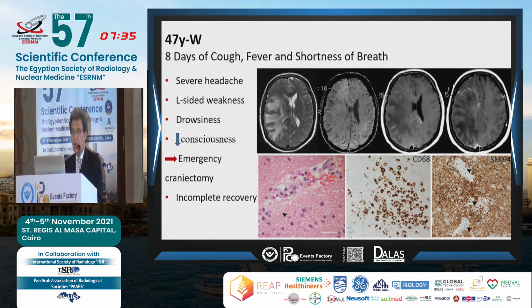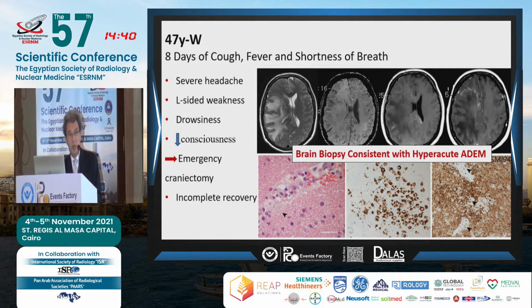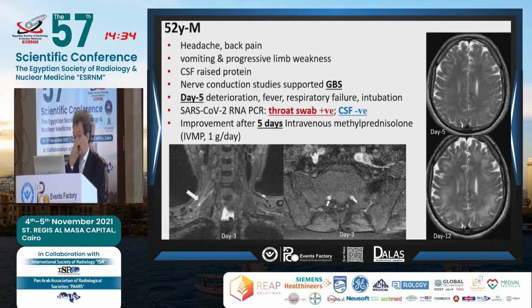A further patient, 8 days of cough, severe headache, then started weakness and loss of consciousness, had an emergency craniectomy. If you look at the scan, you have a midline shift, which is quite substantial, something that is causing a mass, but there's not much enhancement here. You have, however, enhancement in other areas of the brain and a little bit of hemorrhagic transformation in this area. A biopsy was taken because it was unclear what the diagnosis should be, and it turned out to be a hyperacute ADEM. The patient had an incomplete partial recovery.